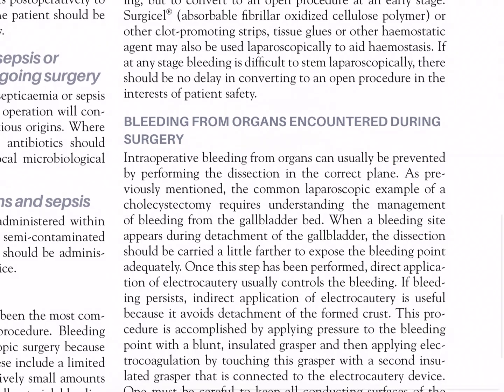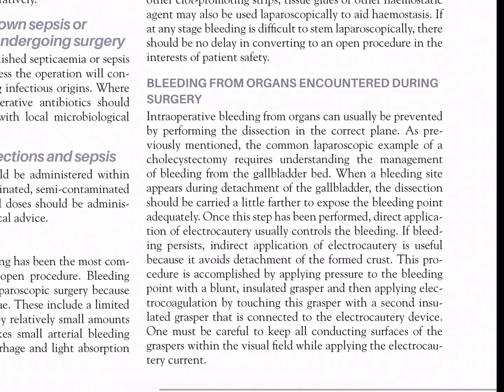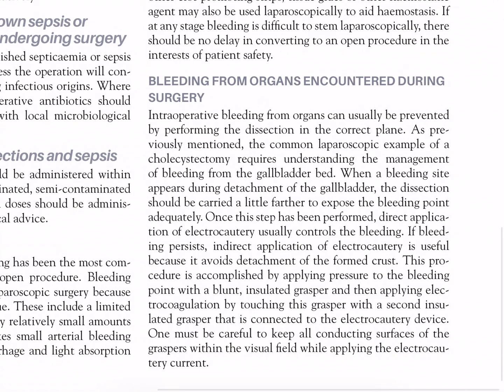Bleeding from organs encountered during surgery. Intraoperative bleeding from organs can usually be prevented by performing the dissection in the correct plane.